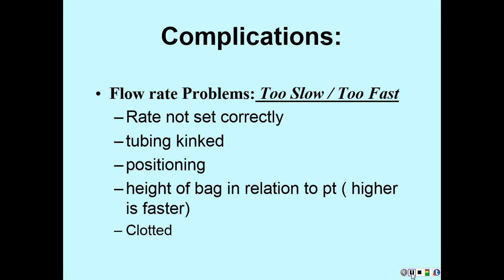Now the great thing about your pumps is they're going to tell you if three-fourths of these are an issue, because it's not going to run and your pump's going to alarm. Okay? Usually if there's any kind of impediment to the flow, then it's going to alarm and let you know that.